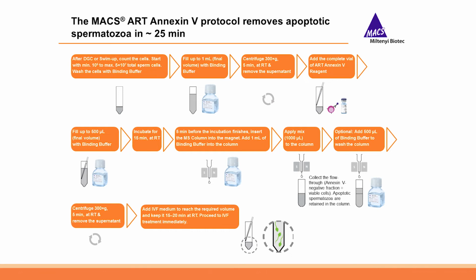During this time, you can already prepare for the next step by inserting the column in the separation unit and washing it with binding buffer, using for example approximately 1 milliliter. And this will, in a way, also activate the flow through in the column. After the incubation, you can apply the mix to the column and collect the flow through. The flow through will contain the Annexin 5 negative fraction, which represents, in this case, the viable cells. And the apoptotic spermatozoa, which are the Annexin 5 positive cells, will be retained in the column.